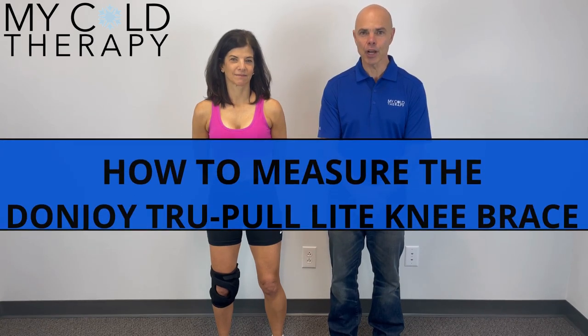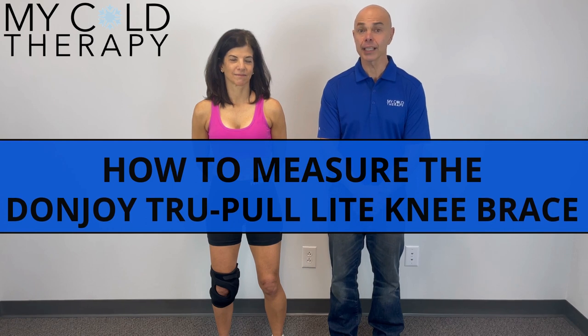Hi, this is Steve from My Cold Therapy, and today we're going to show you how to measure for the Donjoy True Pull Light Knee Brace.